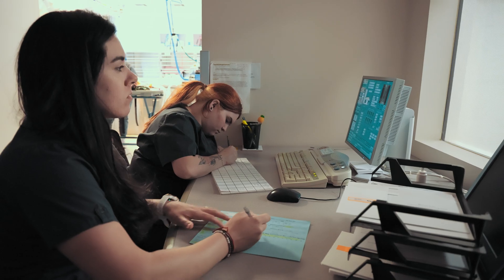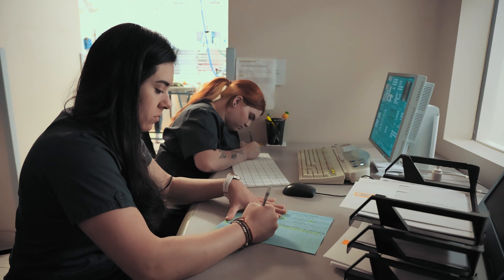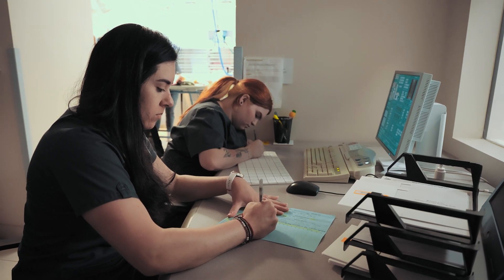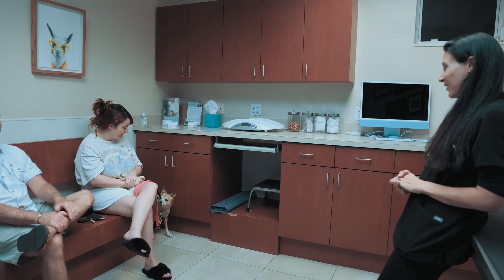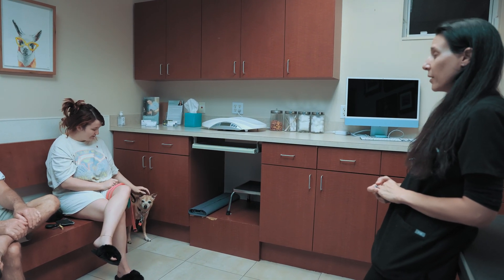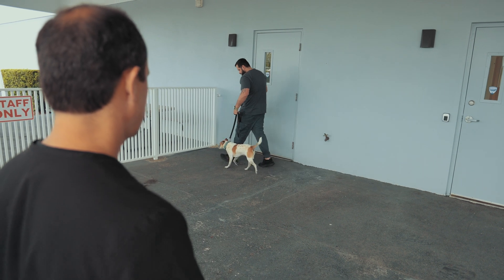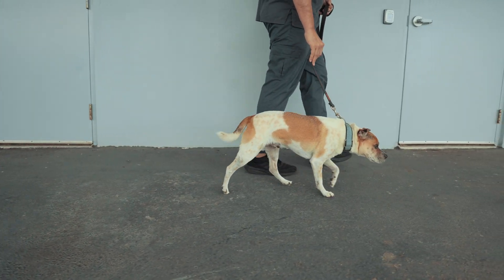With MRI being the gold standard for evaluating the nervous system, we can provide an accurate diagnosis for your pet's best outcome. What that means for you and your pet is that we're more likely to be able to facilitate a positive outcome for recovery. For many neurologic conditions, timely treatment can mean the difference between recovery and permanent damage. If you're considering an MRI for your pet, please don't delay.